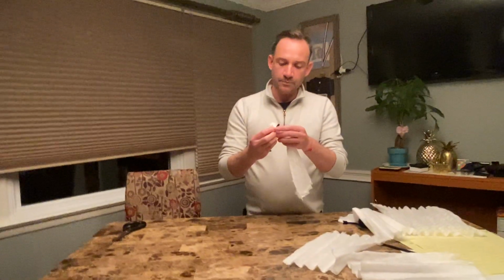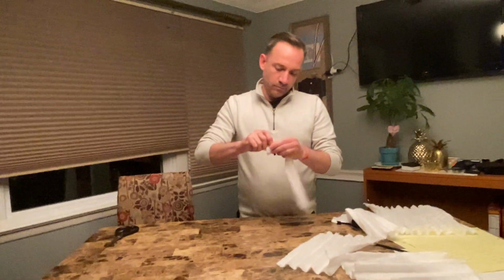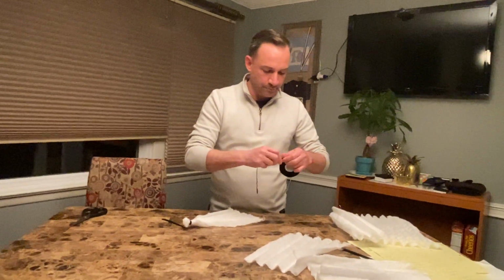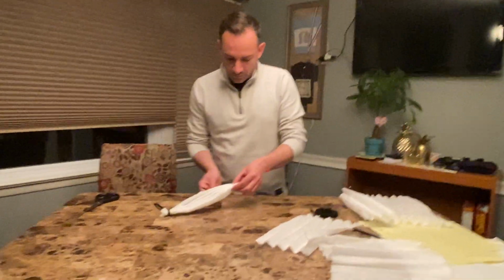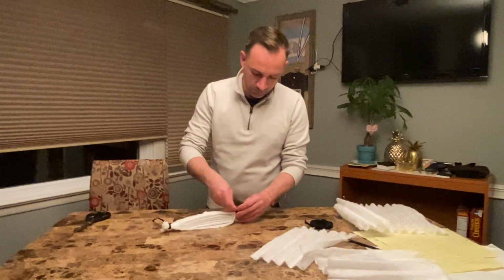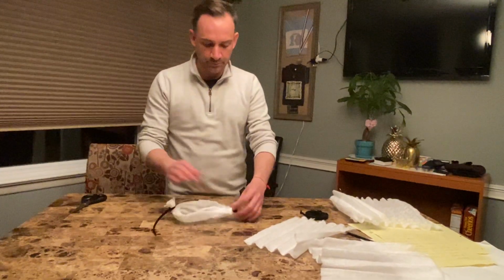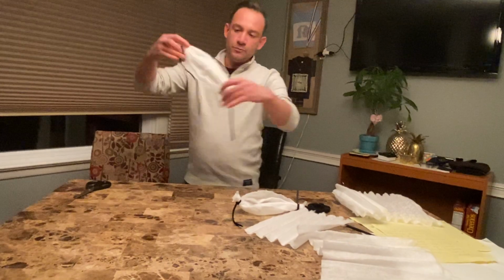This is what I have. Now the other side. Same thing. Tie it up. And boom. I got one ready here.